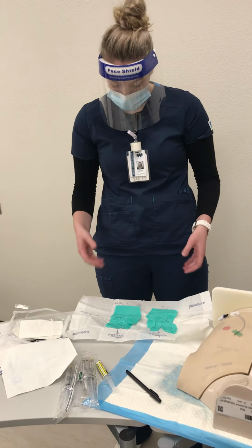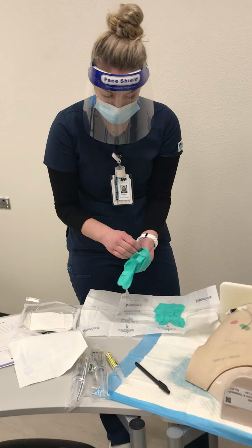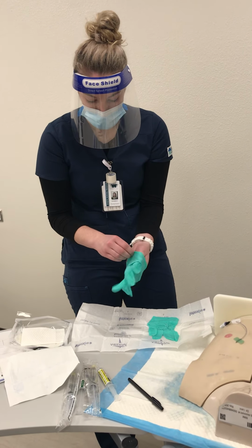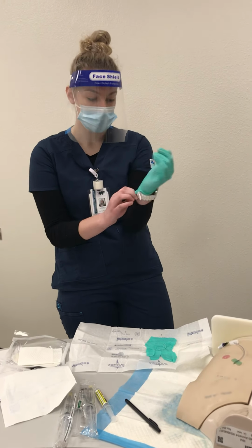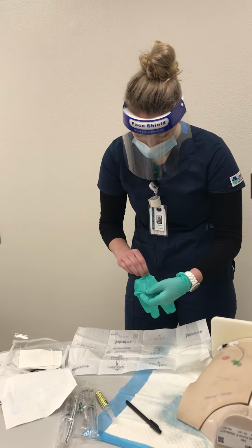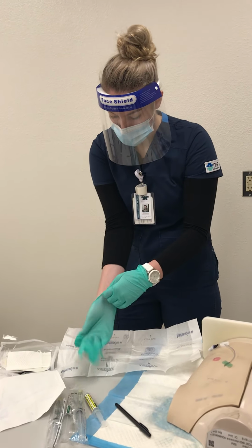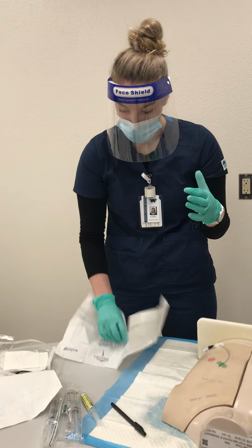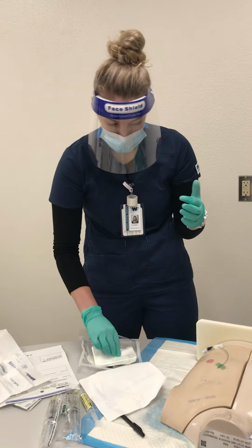Okay, so first we are going to grab the inside of the cuff and slide our hand in. Careful not to touch the outside of the sterile glove, and pull it down from the inside. And then we are going to do the same with this one. And then just pulling it down, making sure to be sterile. So now that I'm sterile, I'm just going to discard this and pull it out of my way. And then I can pull my drape.